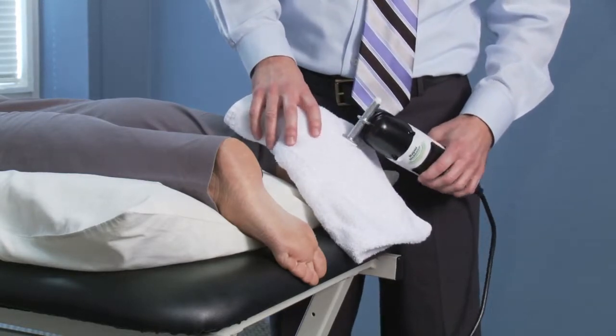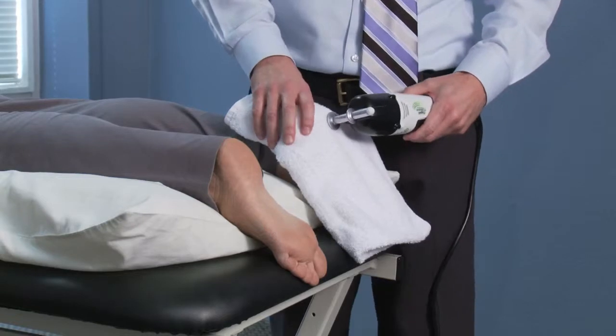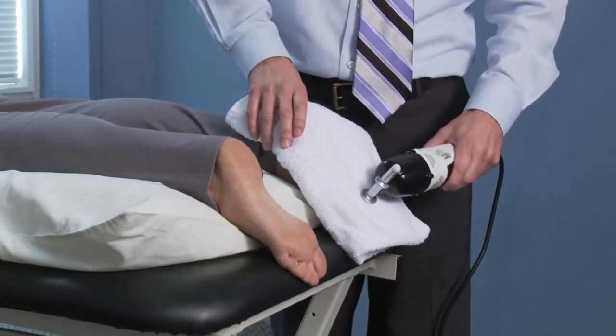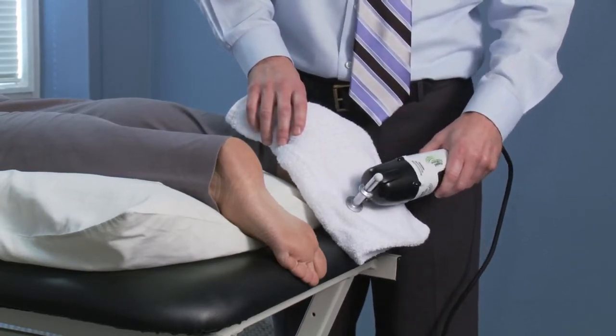If that's okay, then I'll start to do longitudinal strokes across the plantar fascia about one inch per second. I'm applying no pressure — I'm letting the high speed vibration do the work for me.